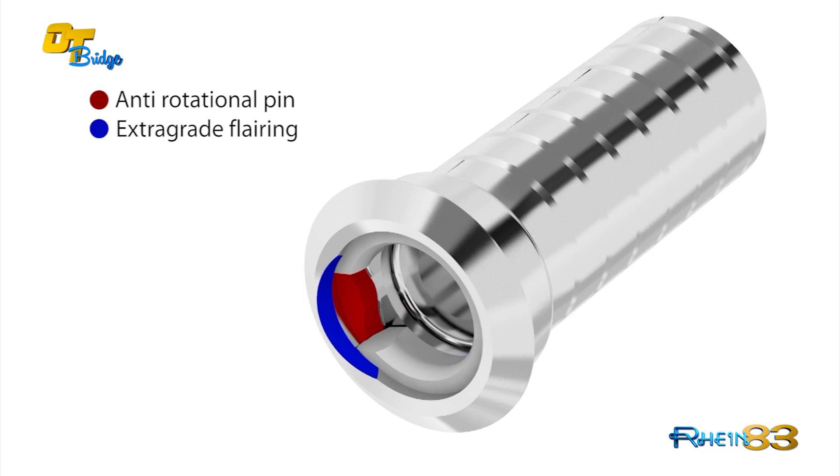The extra-grade flare ring, here marked in blue colour, allows the insertion of the extra-grade titanium abutment also with high divergences.